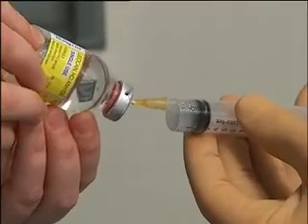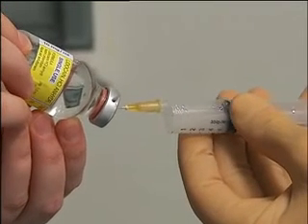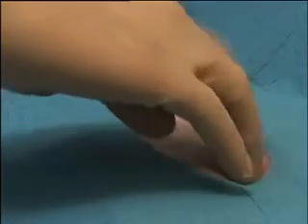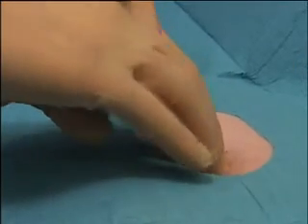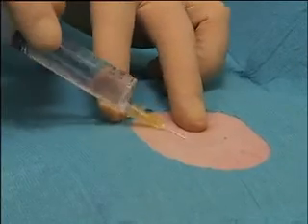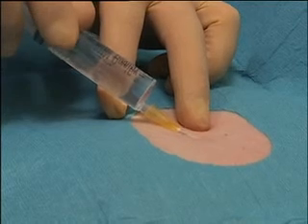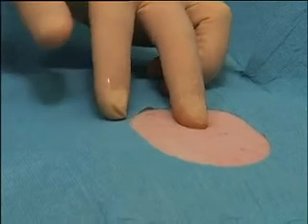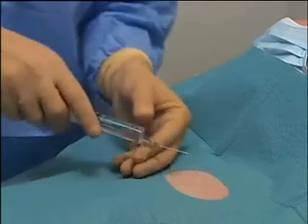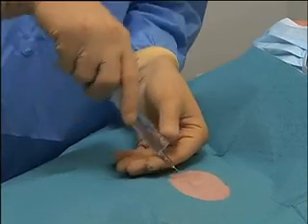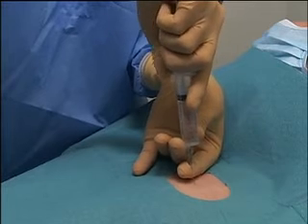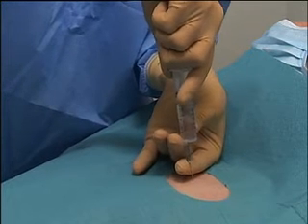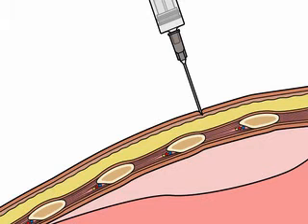Aspirate lidocaine into the 10 milliliter syringe for use as a local anesthetic agent. Using a 25-gauge needle, inject a wheal of lidocaine at the superior edge of the third rib at the mid-clavicular line. Switch to a 22-gauge needle and anesthetize the deeper layers of tissue by inserting the needle at an angle perpendicular to the skin. Before injecting the anesthetic, always aspirate the site to make sure the needle has not entered a blood vessel.